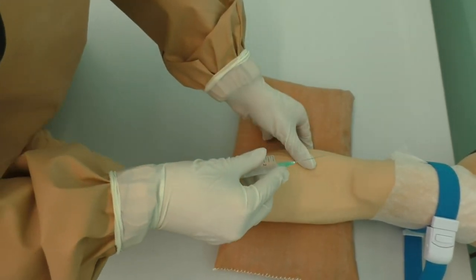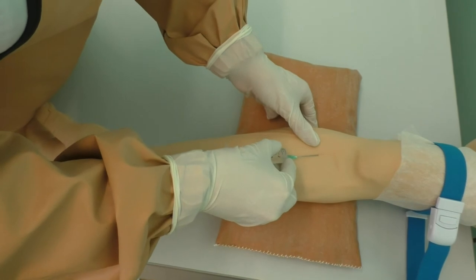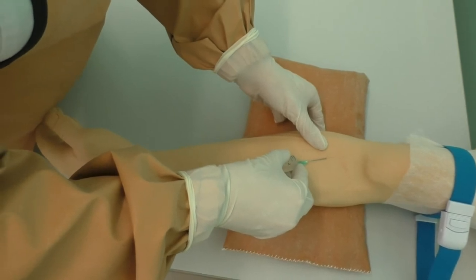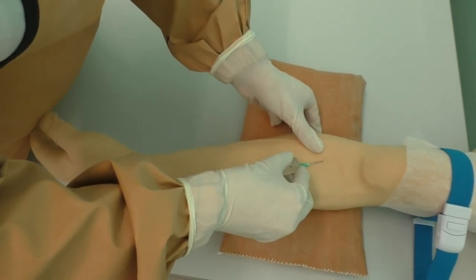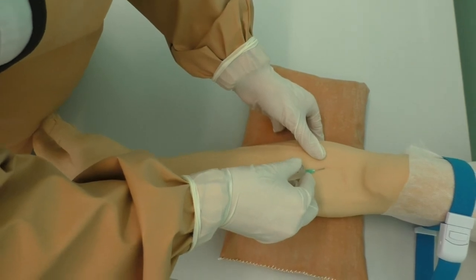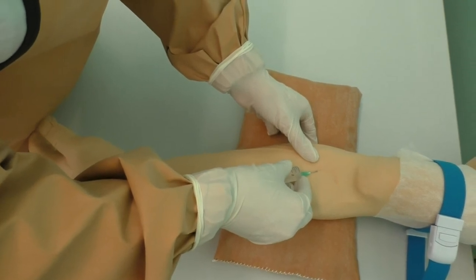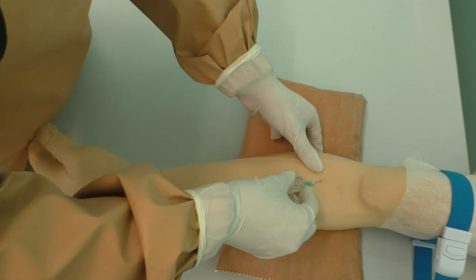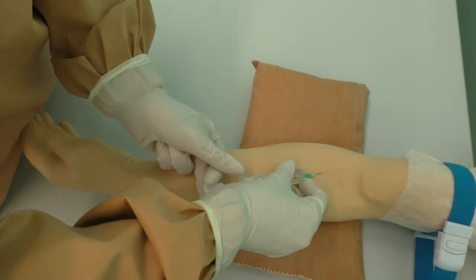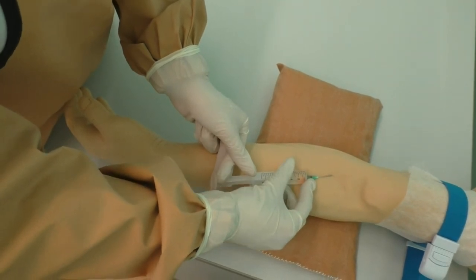Grab the patient's arm to prevent the vein from rolling. Insert the needle at a 15-degree angle into the vessel. You should see blood near the needle hub. Place the fingers of the left hand on the syringe plunger.